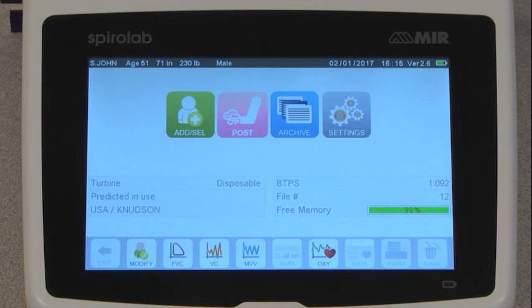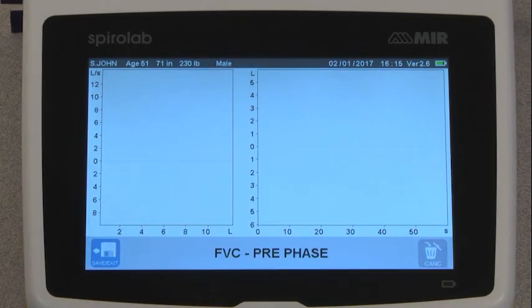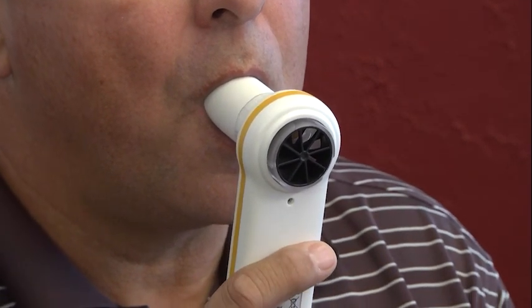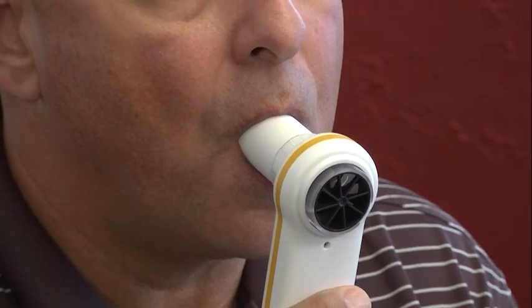We are going to do the FVC test. After you select the FVC icon, you will be taken to the test screen, where you will see the graphs drawn in real time. Have your patient place the mouthpiece into their mouth, making a tight seal with their lips and breathe normally.